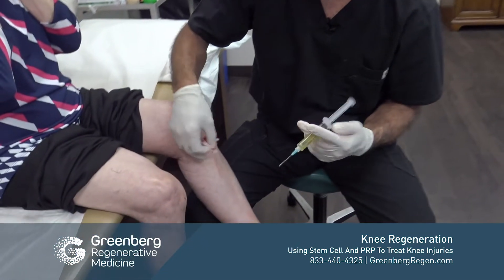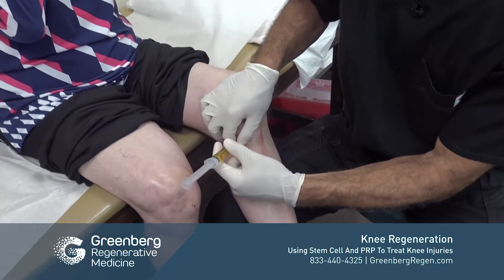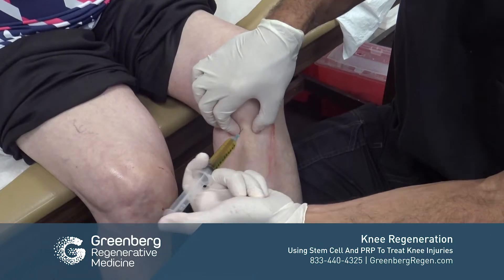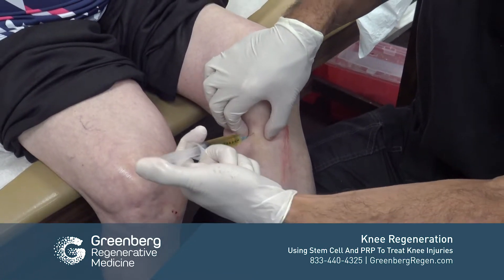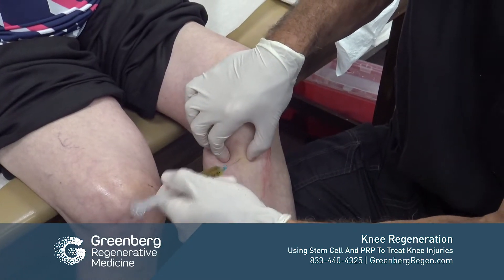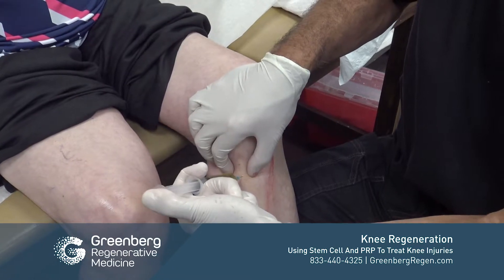As mentioned, the distal portion of the MCL was felt to be weakened during examination. So we're going to treat that as well with something known as PPP, or platelet-poor plasma. The platelet-rich plasma is mixed in with the stem cells.